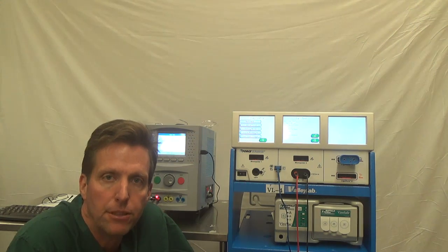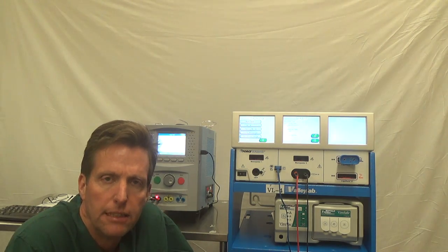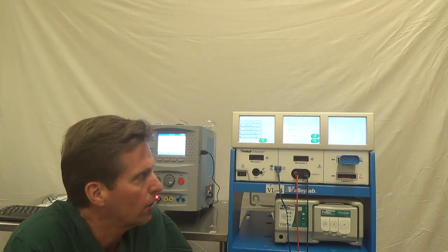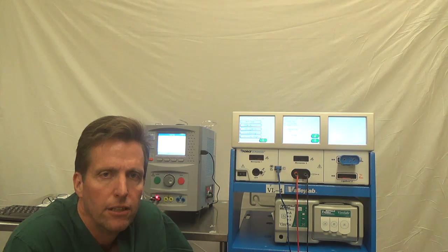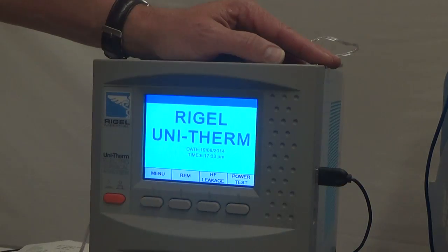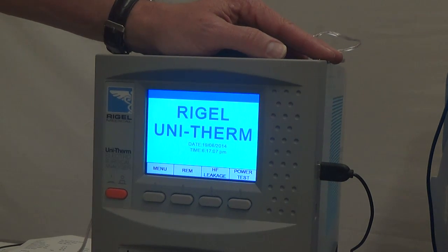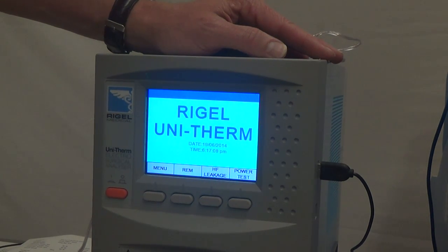Hello, my name is James Knight. I'm a biomed here in the United States. I'm going to demonstrate to you today how to perform a PM on the Covidien Triad using the Rigel Uni-Therm ESU analyzer. So today the Rigel Uni-Therm is being used to perform our ESU PMs.